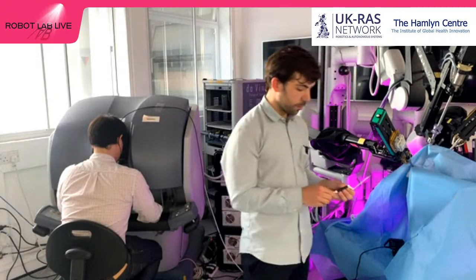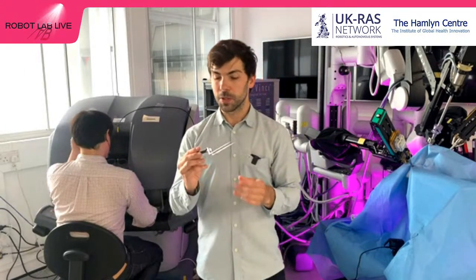And before showing you how this big robot that I have behind me works, I wanted to give you a small introduction of what can be done with robotics. There are many things that can be done, but these two are among my favorite examples. So this is a tool that is used in neurosurgery. It's very lightweight, very precise, very nice to the touch, but it doesn't allow the surgeon to perform beyond his abilities. While if we put some amazing robotic or mechatronic system in it, we will be able to do things that we normally cannot do, that we are limited to as humans.